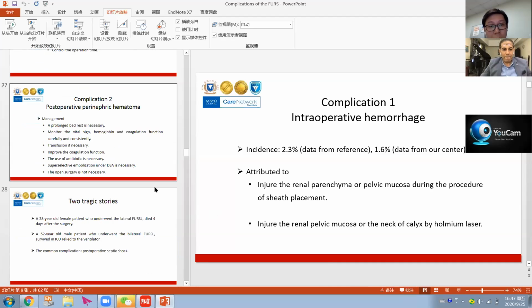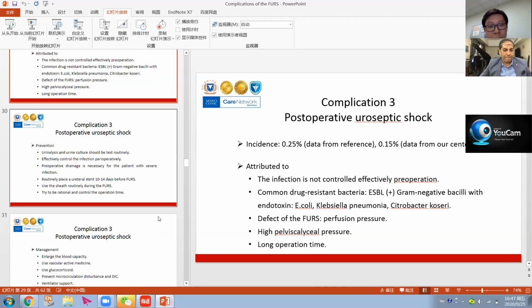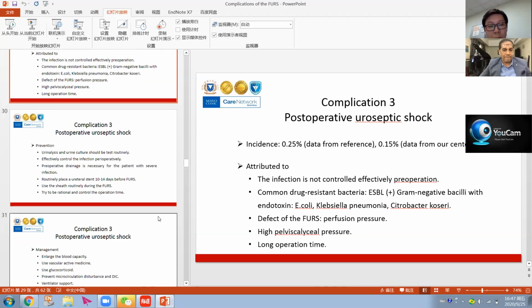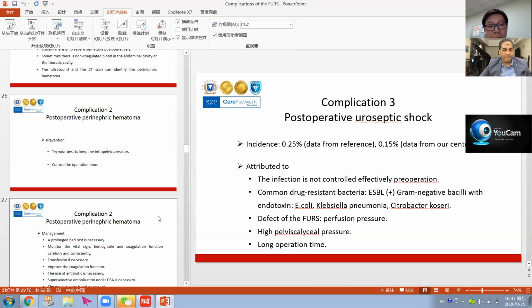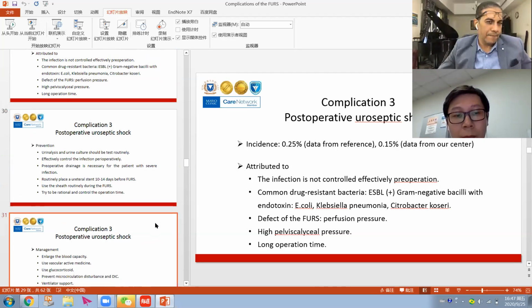What is his opinion regarding cases like this, where we suspect there is an infection? We give antibiotics, and we might put in a percutaneous drainage, a small percutaneous tube, and then proceed with the flexible ureteroscopy. In my opinion, we might reduce or almost prevent any sepsis.